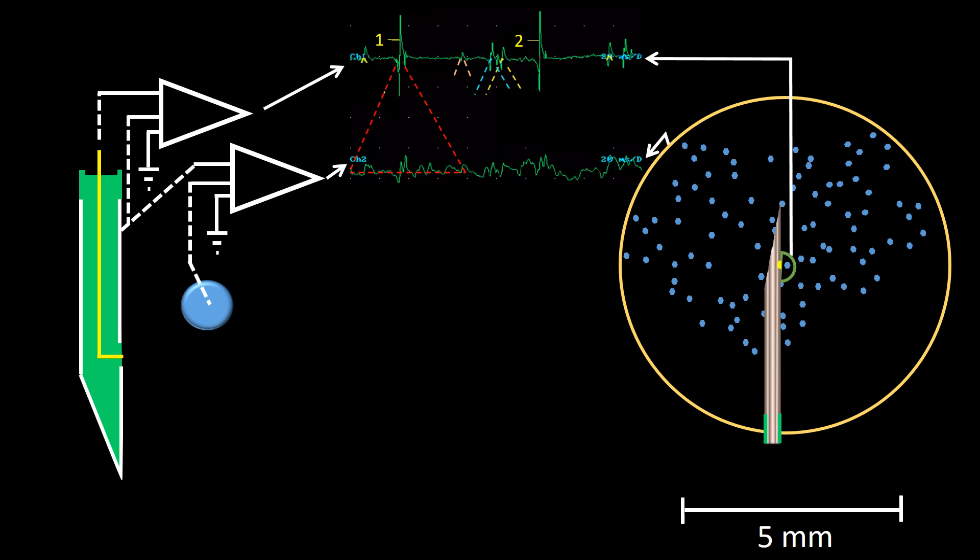The triangle with no base just introduced will not be used for averaging because they do not meet the desired criteria for a prime potential. But the next large potential, a prime potential, will be used to select the segment of the lower tracing to be averaged in relation to it.